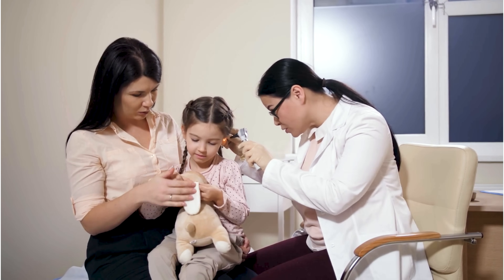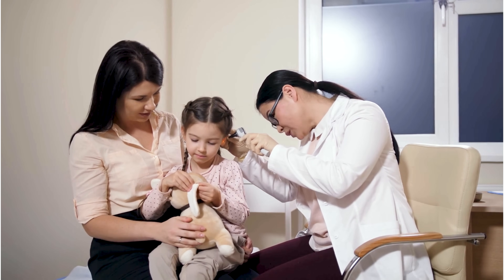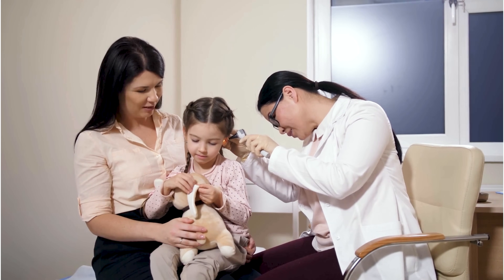I have to admit I'm very excited about today's launch as I'm a big fan of Phonak hearing aids. Before running my own practice, I was working as a paediatric audiologist in the NHS with Phonak hearing aids being the go-to choice. So that means for almost 20 years in audiology, they've played a huge part in bringing adults and children back into the world of sound. So let's take a deep dive into what Phonak have got in store for us.